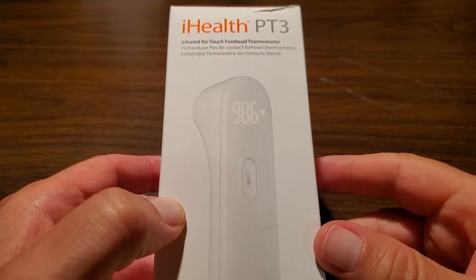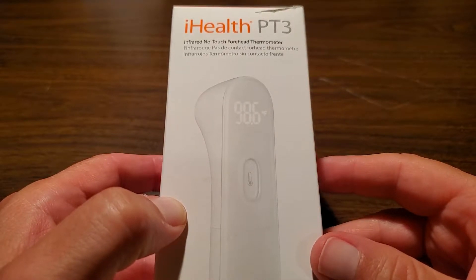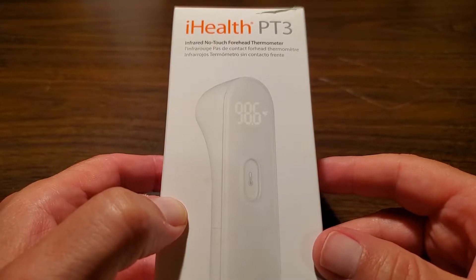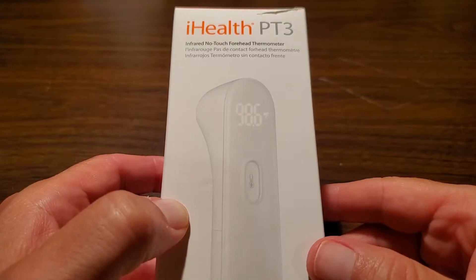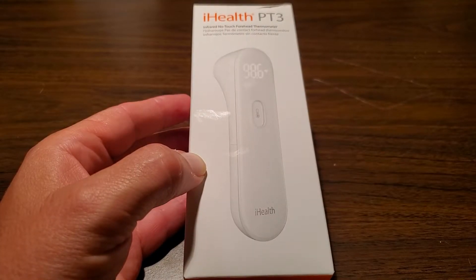I'm going to review the iHealth PT3 infrared no-touch forehead thermometer, and I'll also show you how you configure it to be in either Fahrenheit or Celsius. This thermometer is very easy to use and configure — it only has one button that you hold down to take a temperature, and it returns a reading in less than a second.